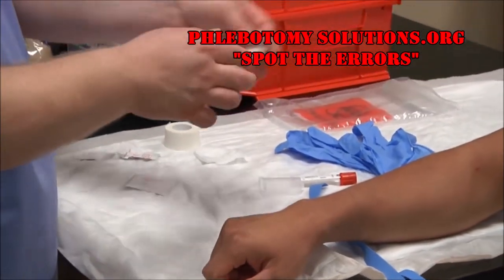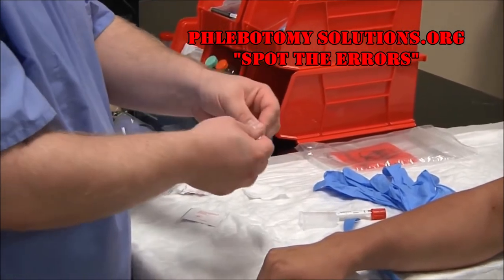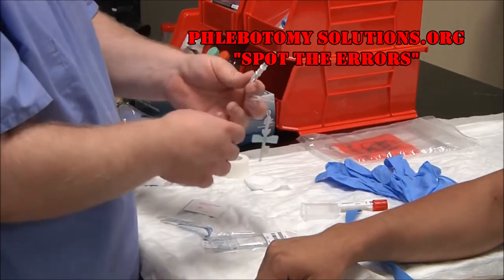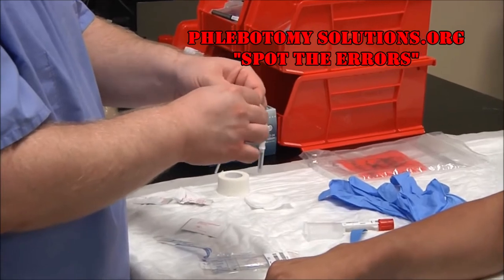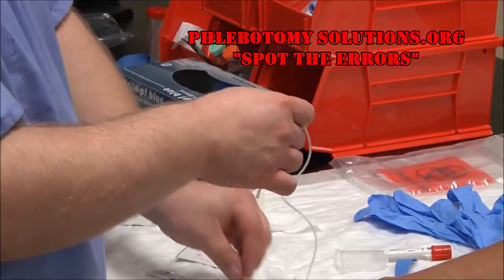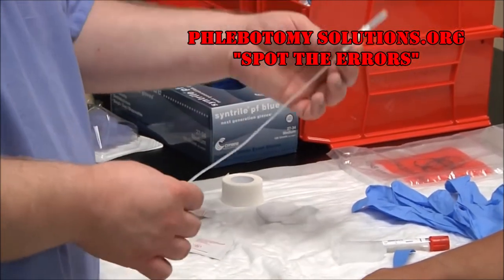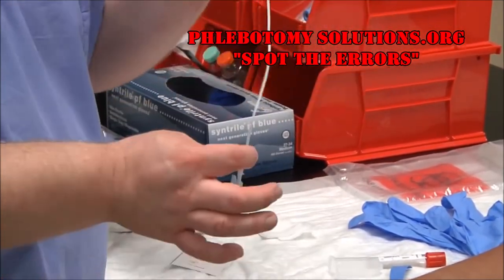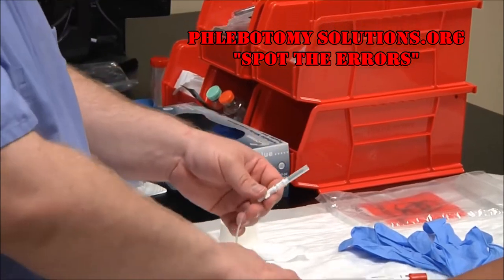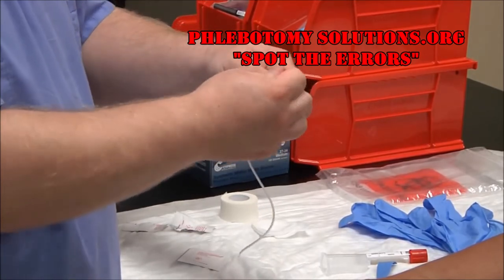Go ahead and assemble your needle, making sure the package is in date — if it's out of date, there's a good chance the needle would no longer be sterile. Every different manufacturer has different packaging styles. This brand has a piece of tape holding the tubes together; simply tear it apart and discard in regular trash. As a phlebotomist, be aware that when drawing with a winged collection set, there is 0.5 milliliters of blood left in the tubing, so take that into account for a calculated draw. Also, check that your luer adapter is tightly twisted into the tubing.